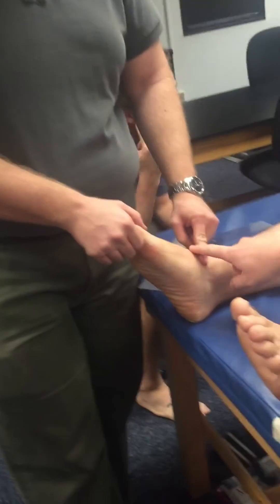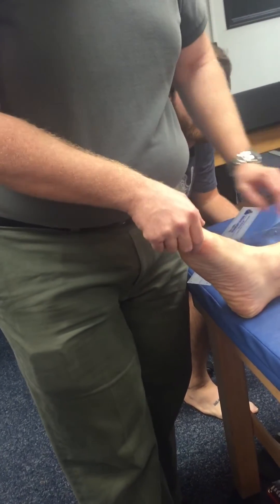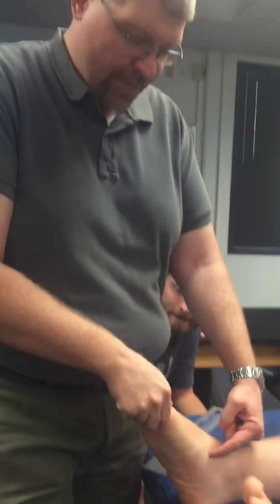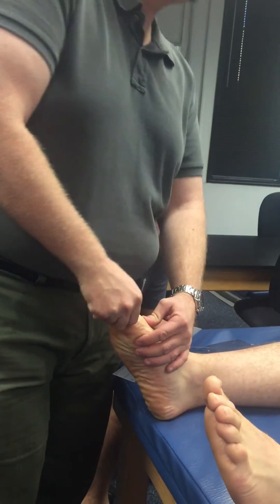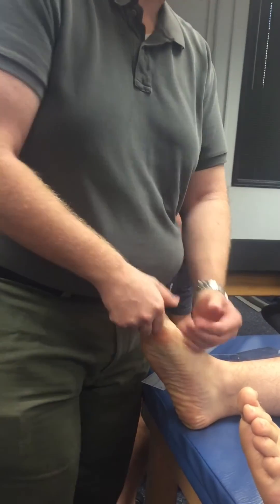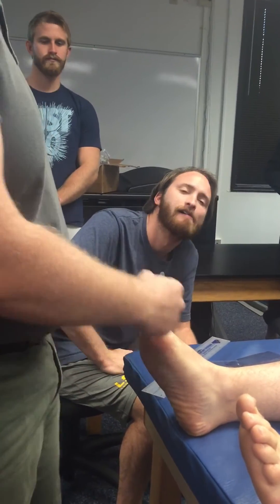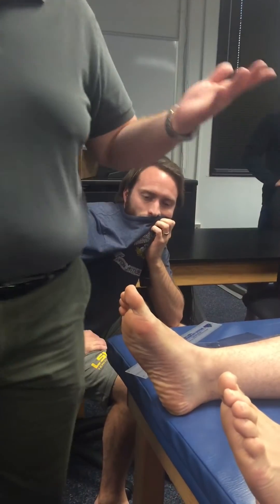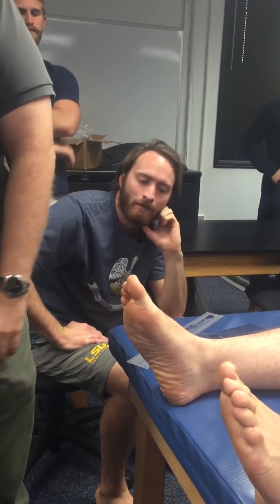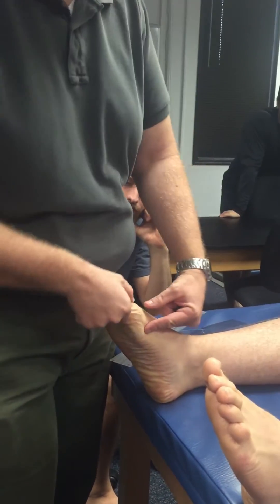Zero is the straight line for flexion and extension — when this is a straight line. If he can go through that imaginary straight line, my measurement will be from zero to whatever number. He happens to sit at rest in a certain amount of extension — that's his resting position. If I wanted to record it, I'd say his resting position is five degrees of MTP extension.